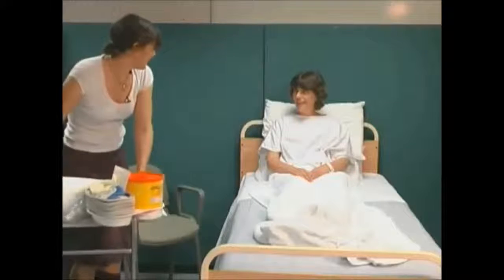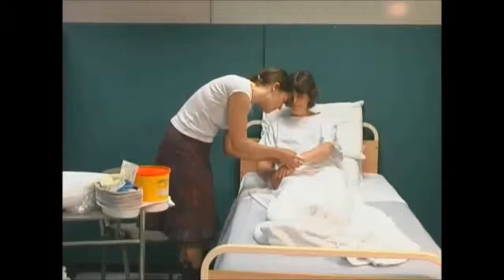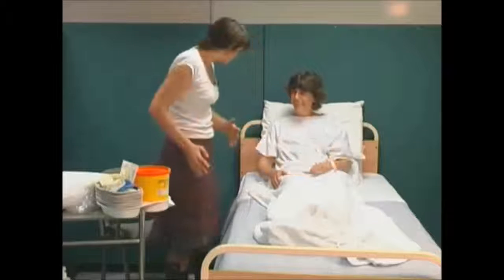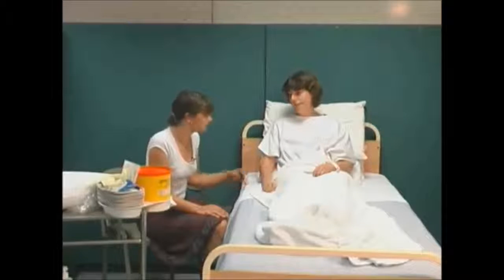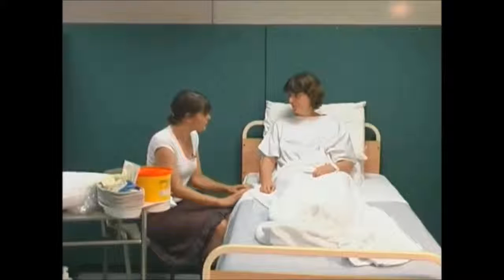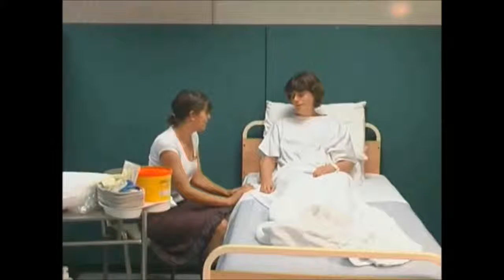Hello, Alice again. Hello. Hi. Can I just check that you are Alice again? Yes. Alice Winter, 10th December 1980, 123456. I've got my equipment, so I'm ready to put the cannula in. Are you still happy for me to go ahead with this procedure? Yes, that's fine. And you still don't have a preference of which arm I use? No, not at all. What I'm going to do now is look and select a suitable vein and prepare myself to cannulate your arm. Okay.